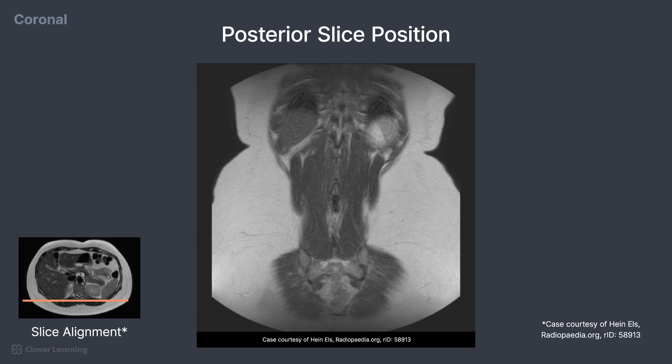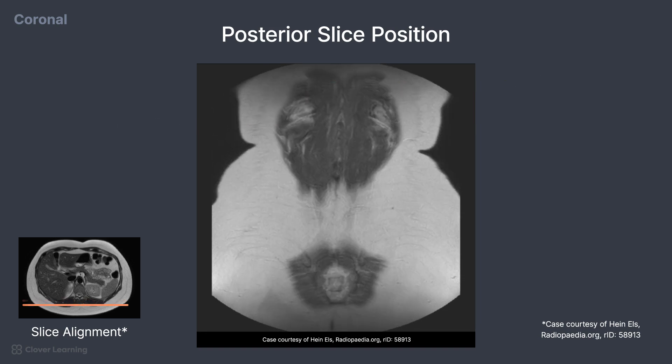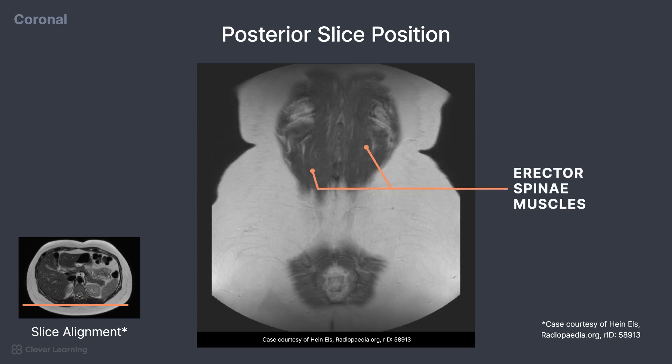Continuing posterior, a small portion of the lungs and small portion of the liver and spleen are still recognizable. On the final slice, we can see the erector spinae muscle group again, and no longer see any abdominal organs.